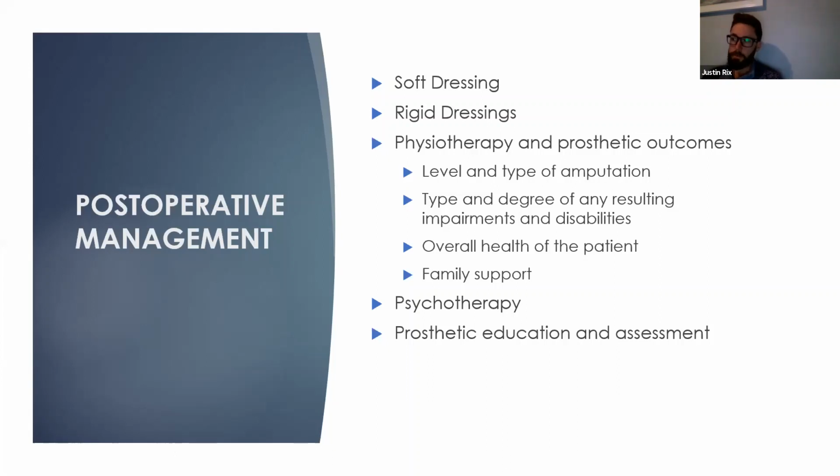Not only does the level of amputation affect the energy expenditure, as we discussed earlier, it also affects the muscle and cognitive involvement to ambulate. With hemipelvectomy amputees, they rely on the upper body to propel the prosthesis forward. They have a prosthetic hip, prosthetic knee, and an ankle joint that doesn't move, so they have to control all these components to sit or stand. Something that is instinctive to us requires a lot of concentration, effort and sensory awareness for them to ambulate safely.